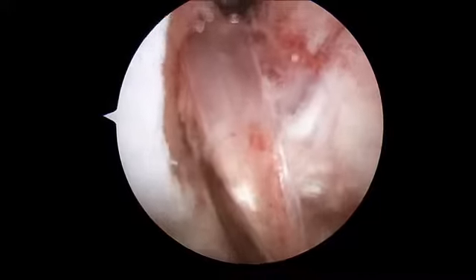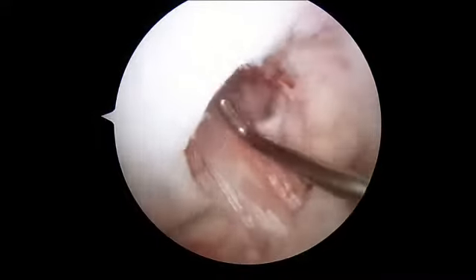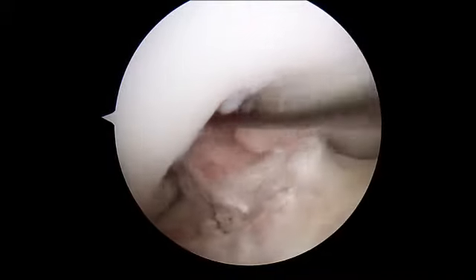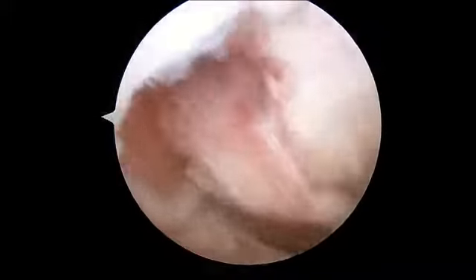We test the ACL, make sure it's not being hit on any side. I'm now bringing the leg into extension, or coming out into a straight position. And again, just making sure that there's absolutely nothing impinging on that new ACL, so it's nice and protected and can heal beautifully.